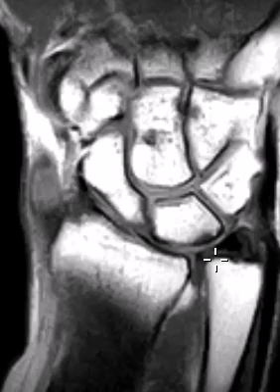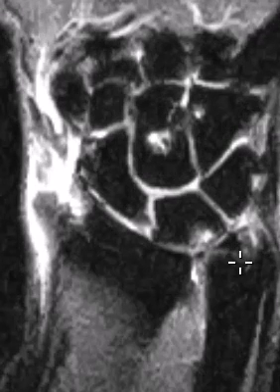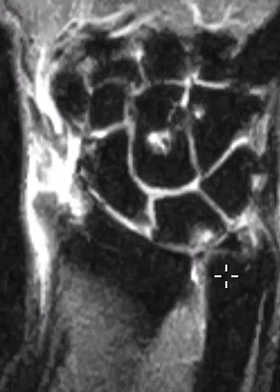Now we'll put up a STIR sequence. Here's the palmar band coming across — looks good. Going to the central cut, right here is that marrow edema. So they have ulnar abutment syndrome. The ulna is banging into the base of the lunate bone — repetitive impaction — and it's starting to tear the TFCC, but I don't see a definite full-thickness perforation yet.